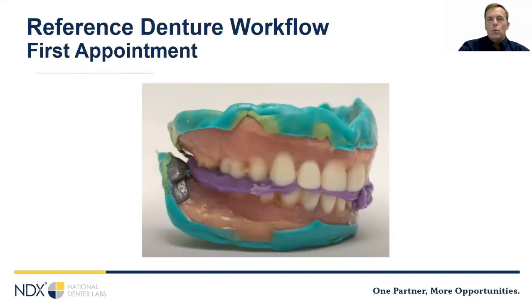If you don't have a denture and you're like, I don't want to do the mush bite thing, you can just take your reference dentures. You can just take an intraoral scan or an impression and then send that to your laboratory, get a bite block, and then reline the bite block and basically do the reference denture workflow with your reline bite block instead.